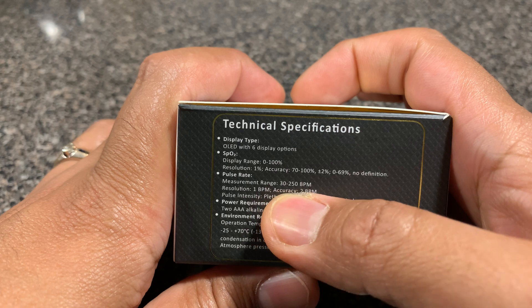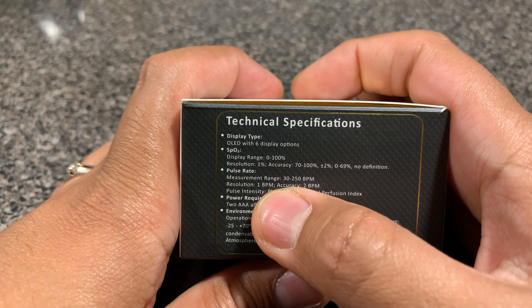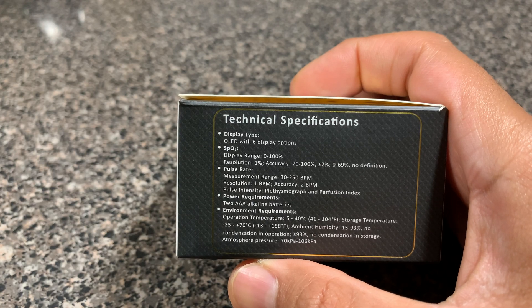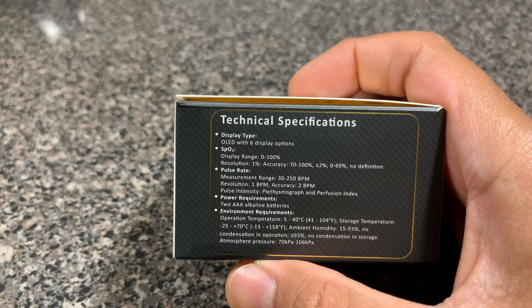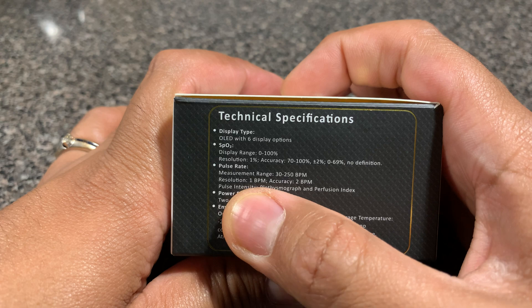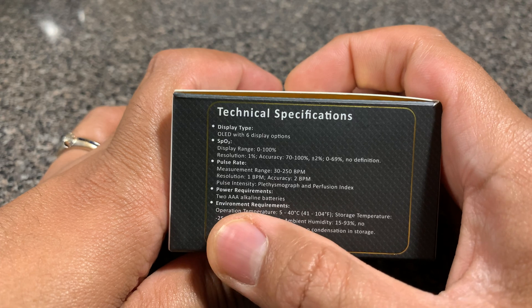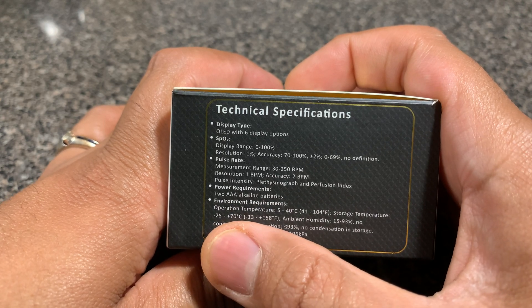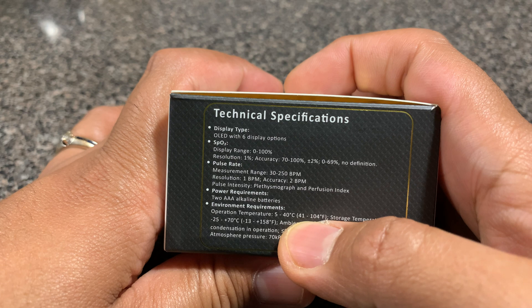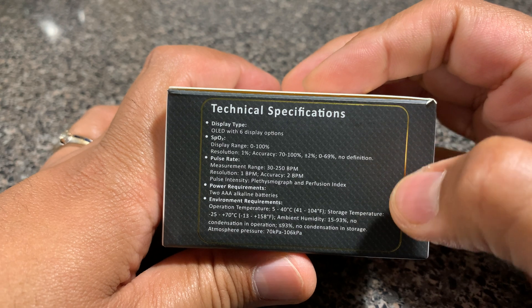The pulse rate measurement range is 30 to 250 beats per minute. For a normal adult this should be between 60 and 100, and if you're in top shape or an athlete, your pulse rate would probably be somewhere between 40 and 60. So the fact that it can handle 30 to 250 is already pretty good. Resolution is one beat per minute and accuracy is plus or minus 2 BPM. Power requirements are two AAA alkaline batteries, and the operating temperature is 5 to 40 degrees Celsius, which is 41 to 104 degrees Fahrenheit — so you're not supposed to use it in a very cold or very hot environment.